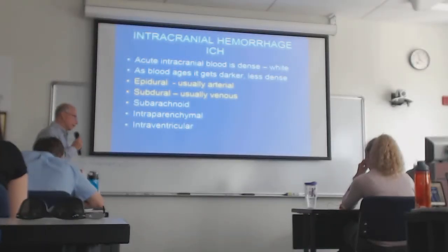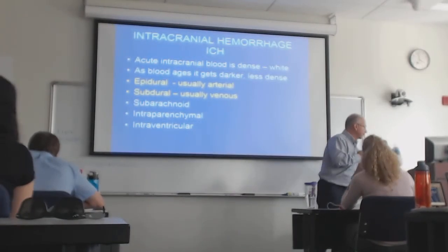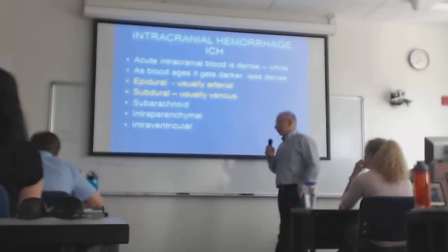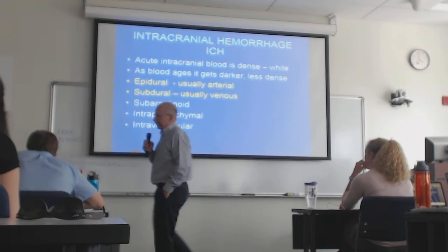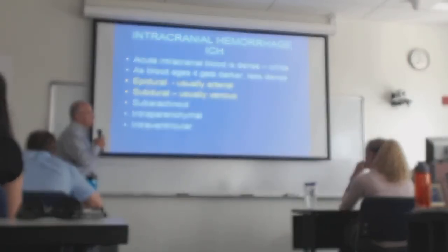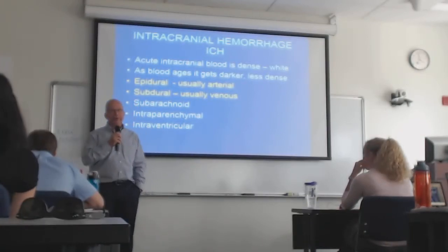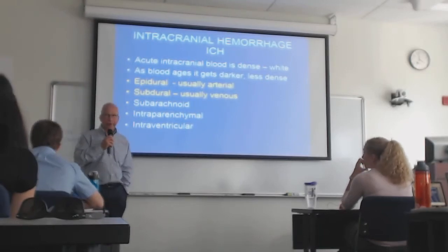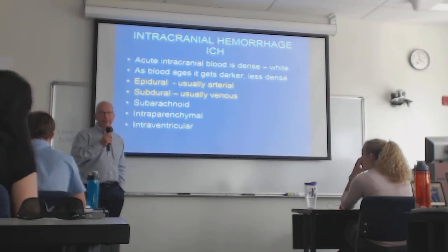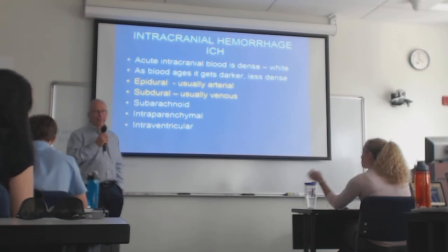Okay, now let's talk about some things that are directly related to imaging the brain. As I've noted several times, CT is the method of choice to identify intracranial hemorrhage. And anybody who comes to the ER with head trauma, it seems that we must exclude intracranial hemorrhage, whether or not they actually even have the remotest chance of having it. Because you tell an ER doc that you hit your head, and he's going to get a head CT.